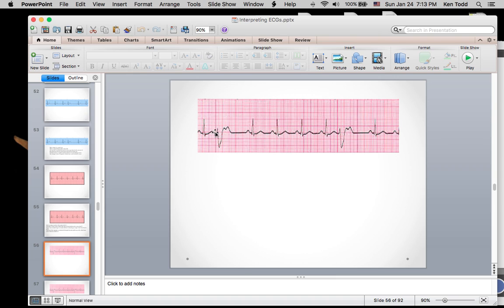These are different. Since this was conducted bizarrely or abnormally through the heart, it depolarized abnormally, so it's going to repolarize abnormally. So these kind of get thrown out the window when you're looking at ST elevation to determine infarction. So don't look at these. You can't look at this whole strip and go, oh, there's ST elevation here and here, so they must be having a heart attack.